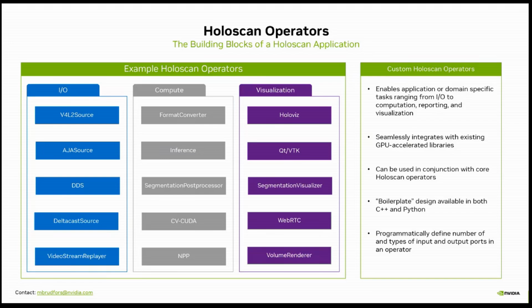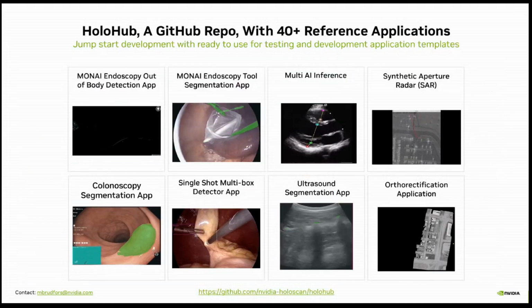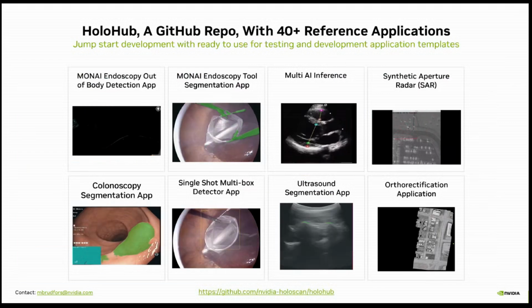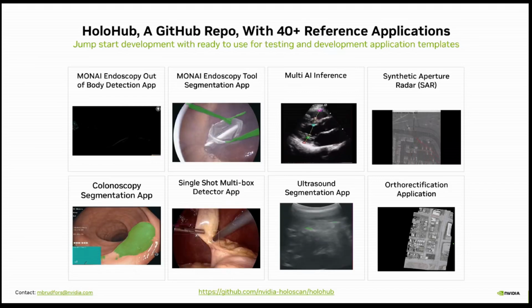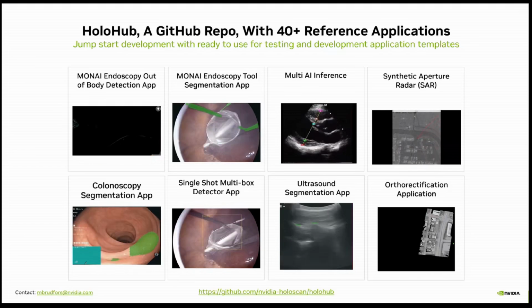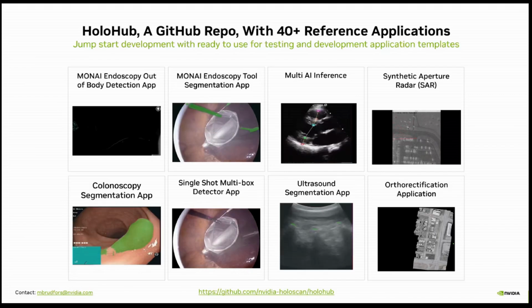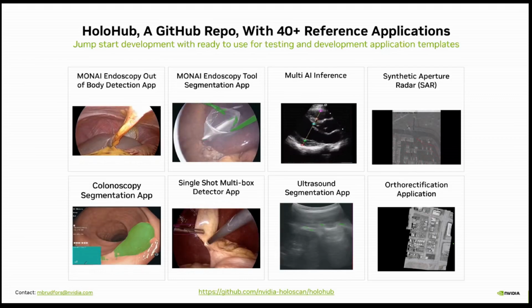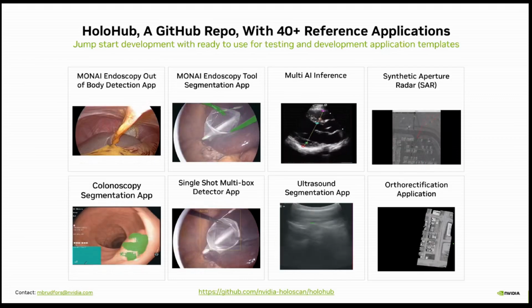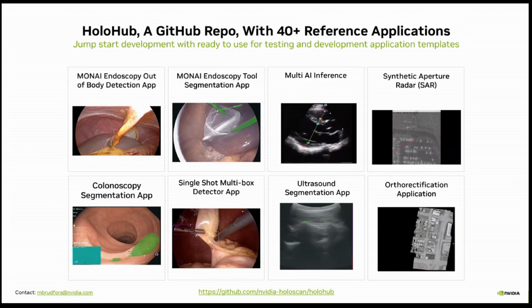QT, mentioned earlier, and WebRTC, well, maybe some of you are familiar with some of the drivers. And there's also the HoloHub. This is a separate GitHub repository where there are sample applications and sample operators contributed. Here you can find sample applications for endoscopy, out-of-body detection, multi-AI inference, ultrasound, but also non-healthcare related, because this SDK is not healthcare specific. There are requirements on large data being taken from some sensor also in things like astronomy, particle physics, or other applications.